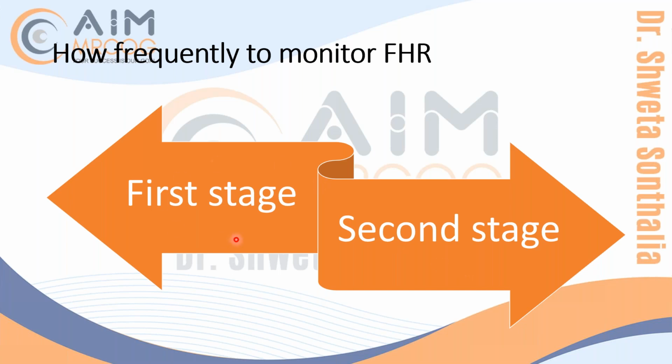Now, when you monitor the baby, will you monitor it before contraction, at the time of contraction, or after contraction? How long do you have to monitor the baby when you check for the fetal heart? Can anybody tell me that? Ma'am, immediately after the contractions, for 1 minute. Very good. Immediately after the contraction, and you have to monitor it for a full 1 minute.